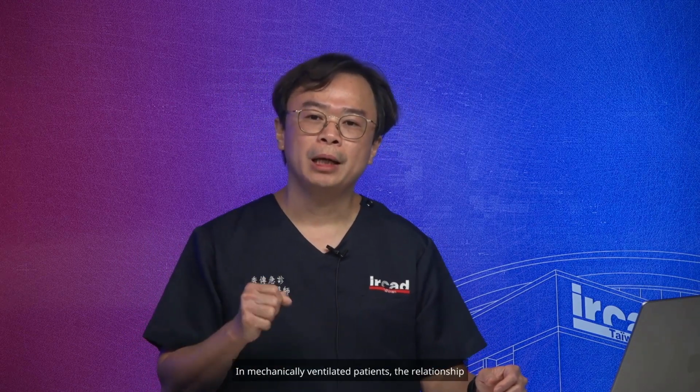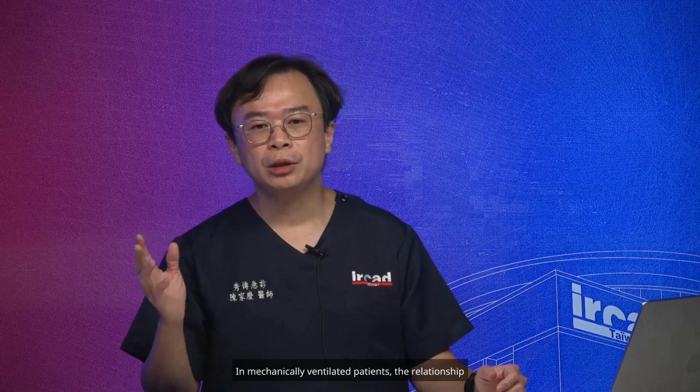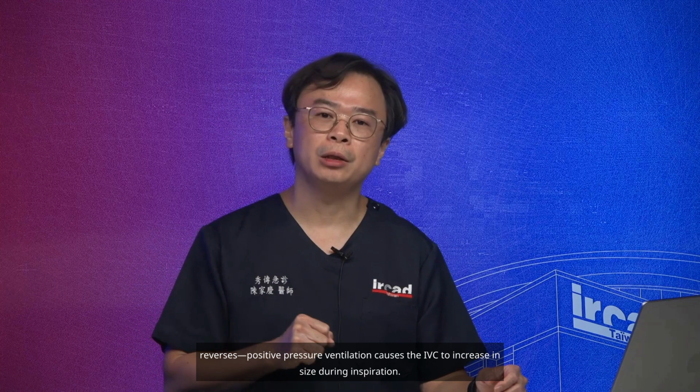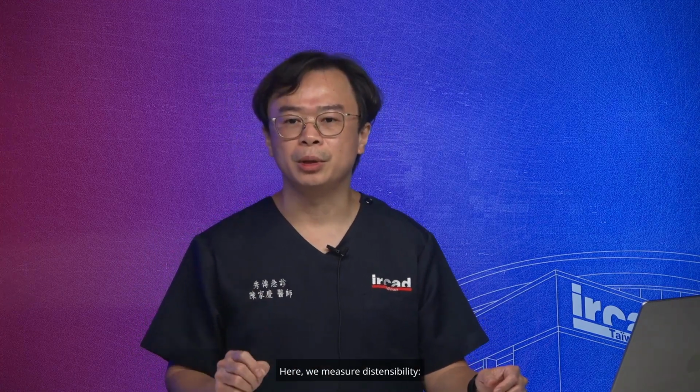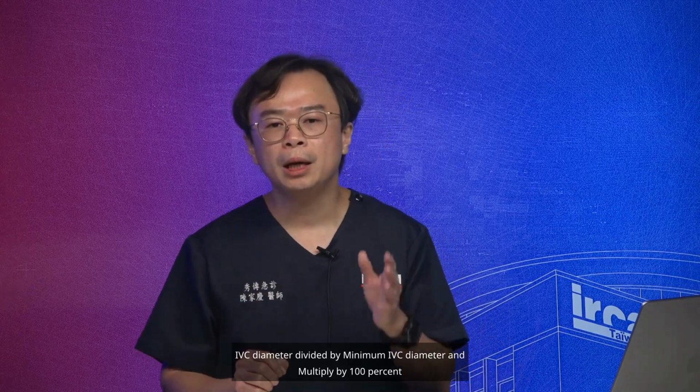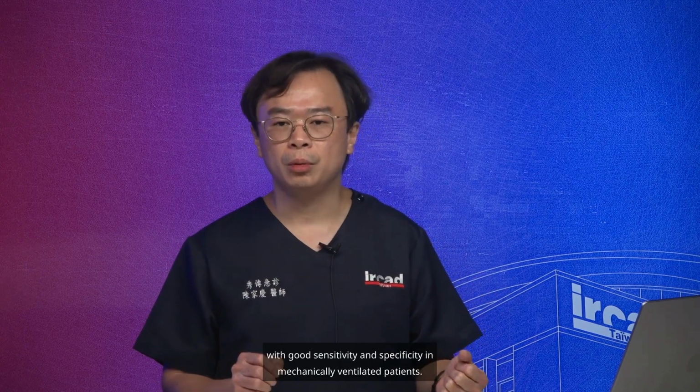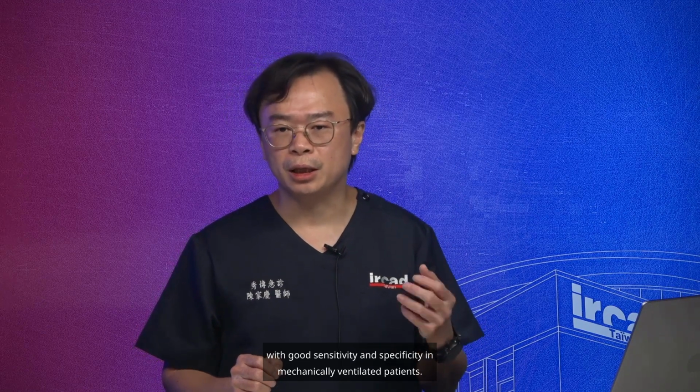In mechanically ventilated patients, the relationship reverses. Positive pressure ventilation causes the IVC to increase in size during inspiration. Here, we measure distensibility. Distensibility index is equal to maximum IVC diameter minus minimum IVC diameter divided by minimum IVC diameter and multiply by 100%. A distensibility index of more than 18% predicts fluid responsiveness with good sensitivity and specificity in mechanically ventilated patients.